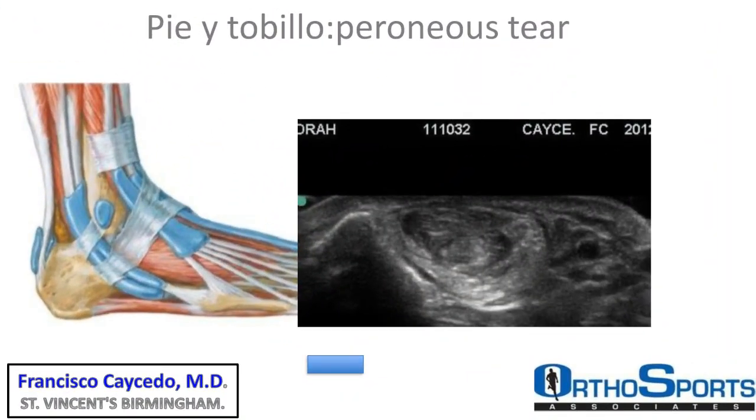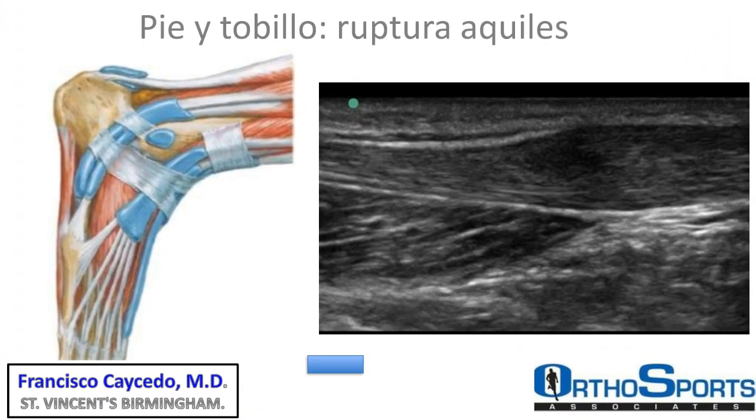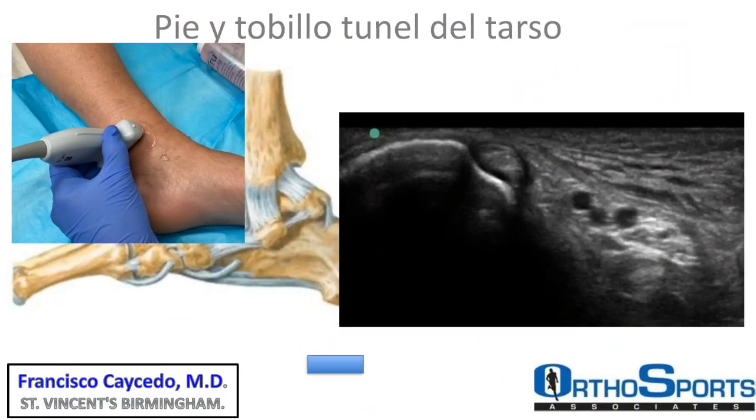Again, in the transverse aspect of the peroneus tendon, you can see only one tendon, and a very amorphous signal is the tenosynovitis. The patient has a chronic peroneal tenosynovitis with rupture of the tendon. When you do the dynamic test, you only see one tendon. And here in these patients, we go proximal, and we found at about 4 or 5 centimeters, actually, you can see what exactly is the lesion. You can see a rupture of the Achilles. So you can plan your surgery and your incision.